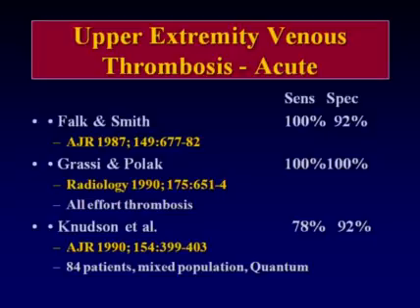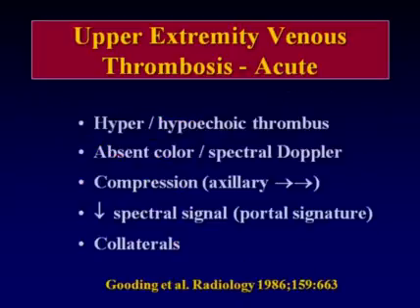Also one by Joe Pollack, which showed 100% sensitivity and specificity. Now, Joe's really good, but the reality of it is these were all effort thrombosis patients. They had massive thrombosis, so you really should have 100% sensitivity and specificity in a population like this.